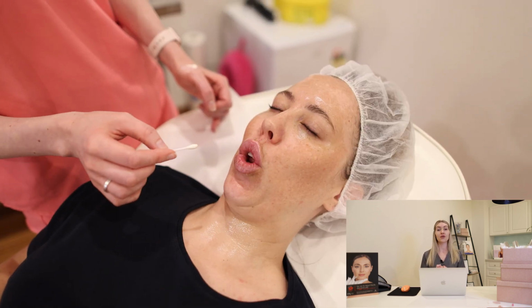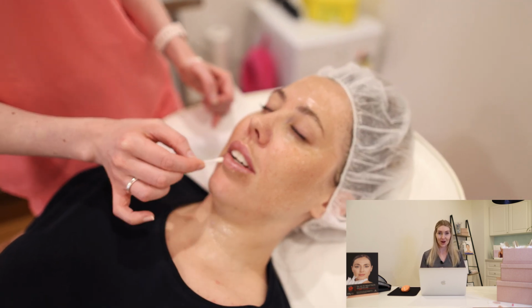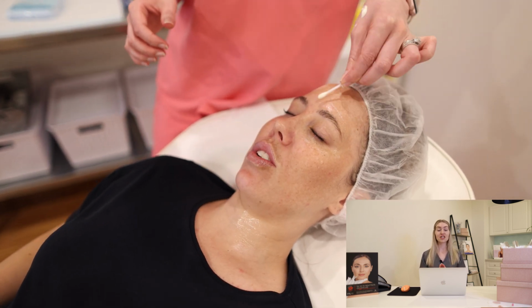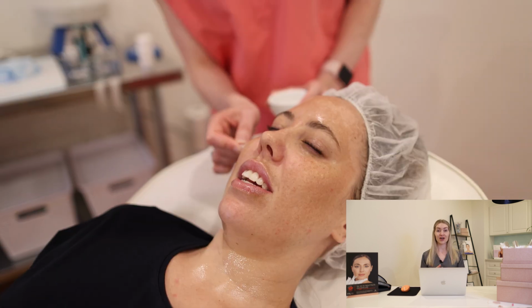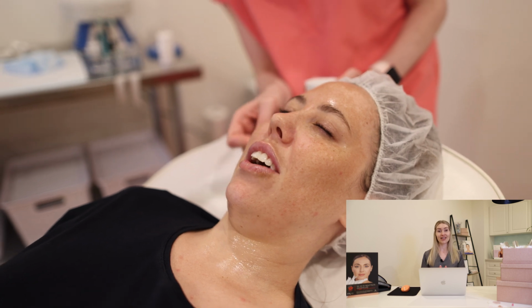This was her first treatment with the TCA peel. So when she comes back in about 4 to 6 weeks for her repeat one, we may push the skin and do 4 layers the next time. One of the things I love about this peel is it is self-neutralizing, so we don't need to wash it off. Once the peel has finished, we do then just follow with some moisturizer, of course, that has sunscreen in it, and then you don't need to touch the skin for the rest of the day.